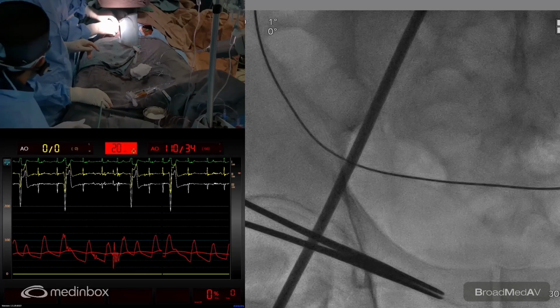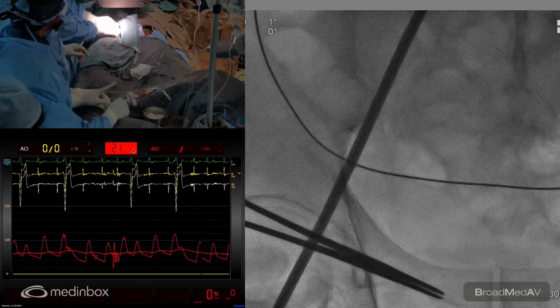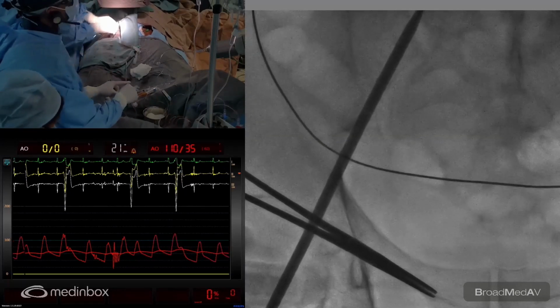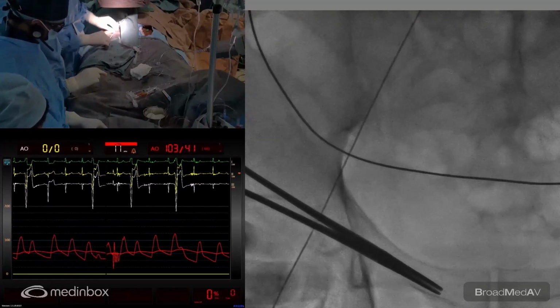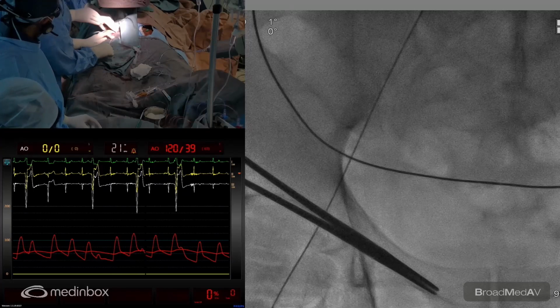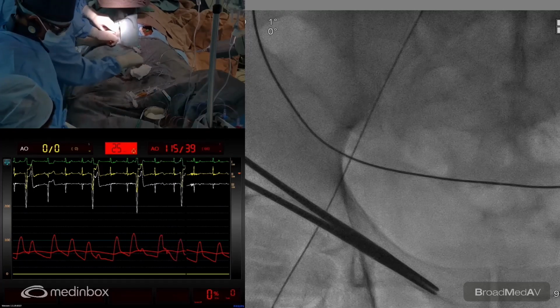We could quickly access the coronary after keeping a guiding catheter and wire across, in case the balloon closes, if we are suspicious of the balloon closing the coronary ostium.